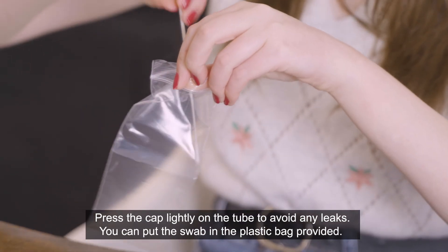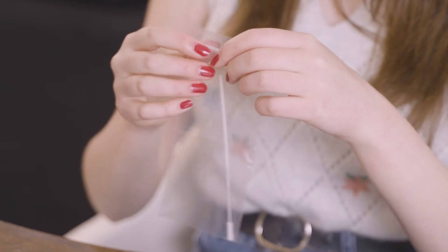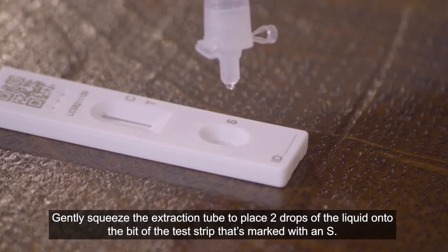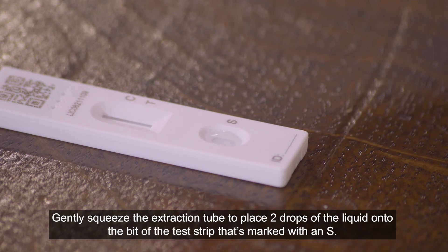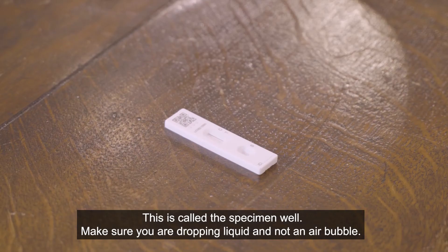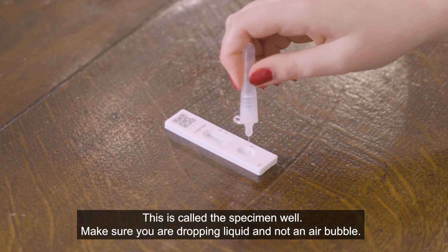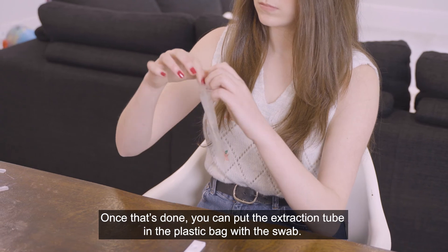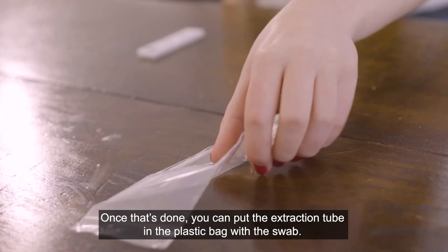You can put the swab in the plastic bag provided. Gently squeeze the extraction tube to place two drops of the liquid onto the part of the test strip marked with an S — this is called the specimen well. Make sure you are dropping liquid and not an air bubble. Once that's done, you can put the extraction tube in the plastic bag with the swab.